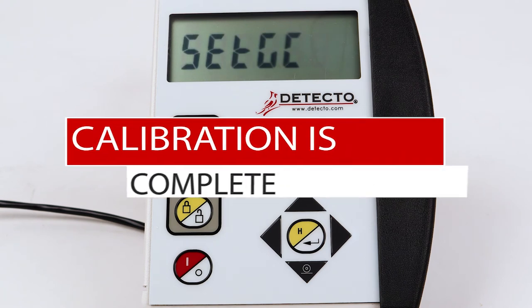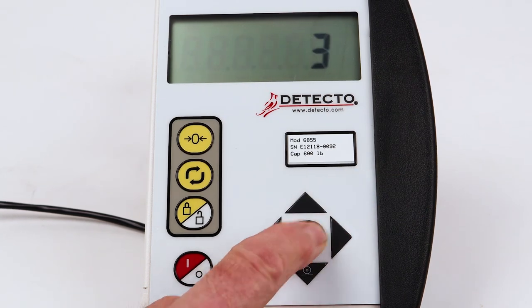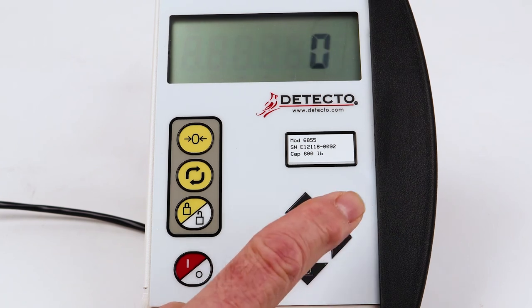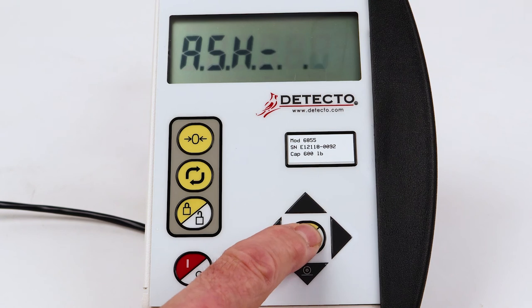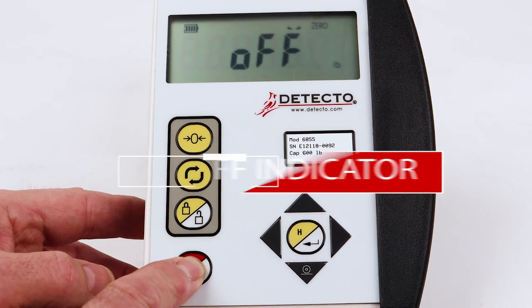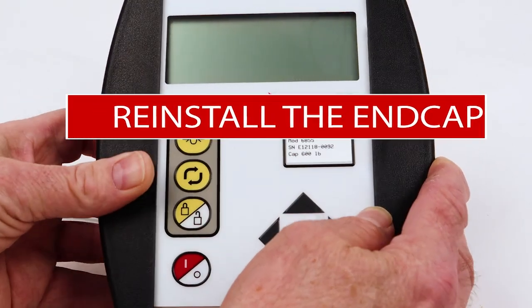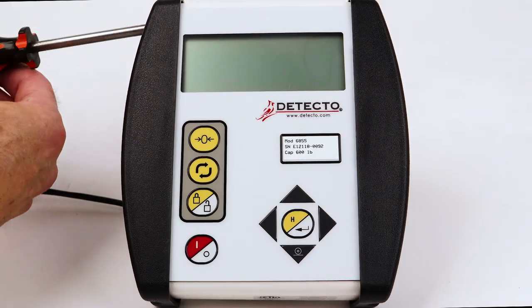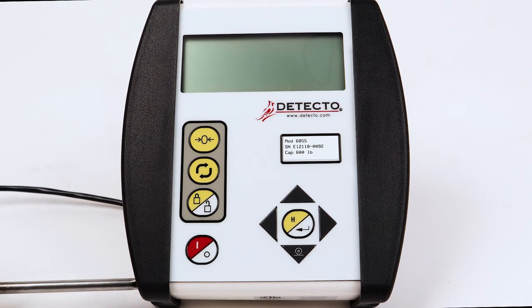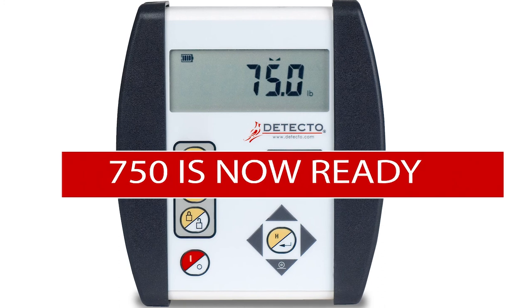Calibration is complete. Press the BMI Enter key repeatedly until the indicator resets and returns to the weight display. Press the on-off key to turn the 750 off. Using the two screws removed earlier, reinstall the end cap. The 750 is now ready for normal operation. Your medical scale is now ready for accurate weighing.